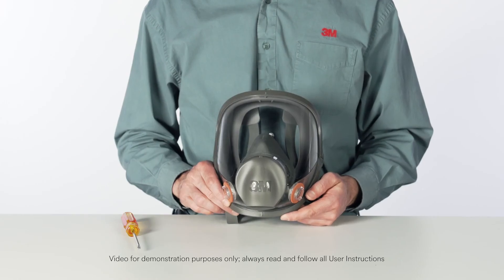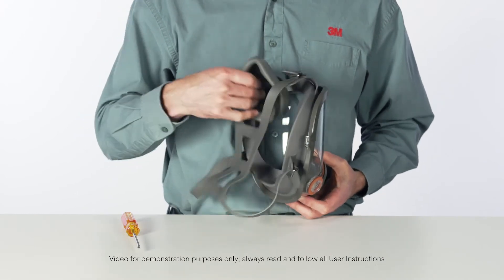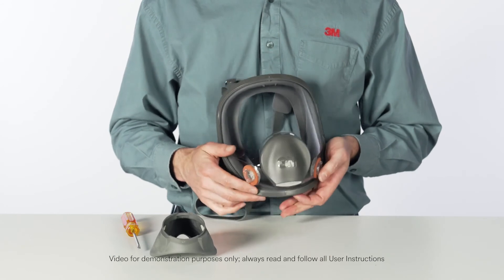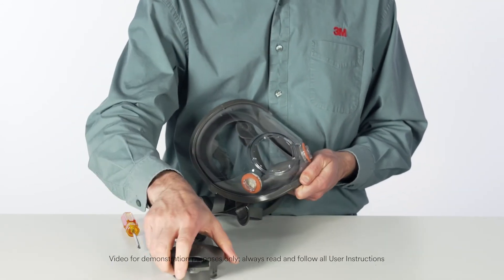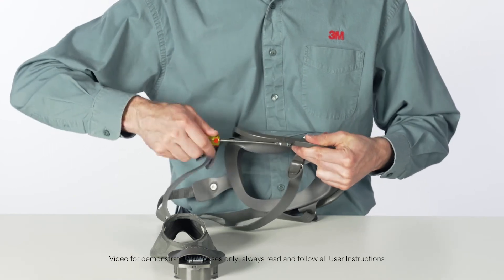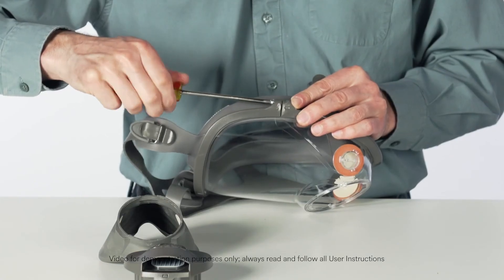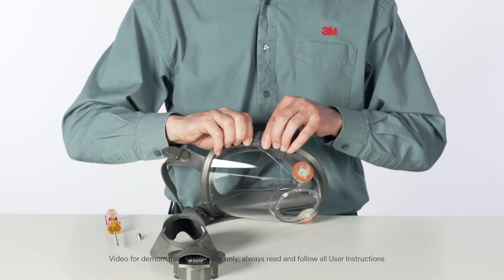Remove the nose cup assembly from inside the facepiece. Remove the center adapter assembly from inside the facepiece by turning it counter-clockwise one quarter turn and withdrawing it from the lens center port. Remove the two Phillips screws from the frame.